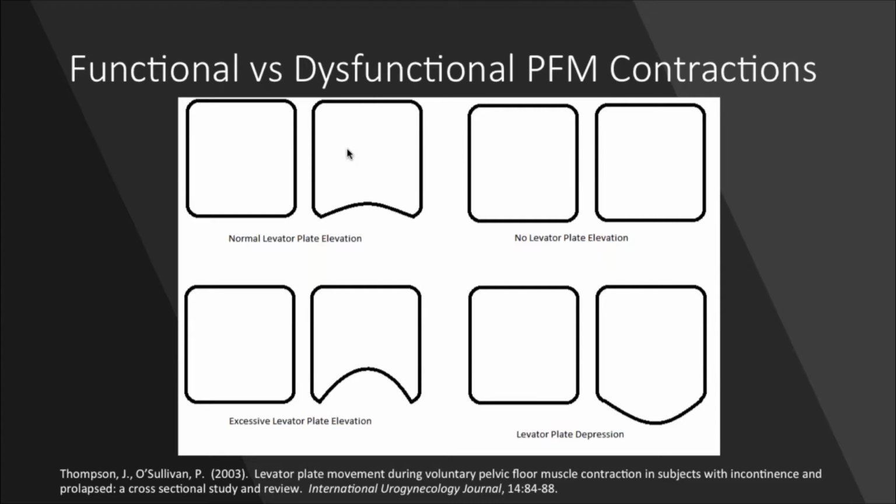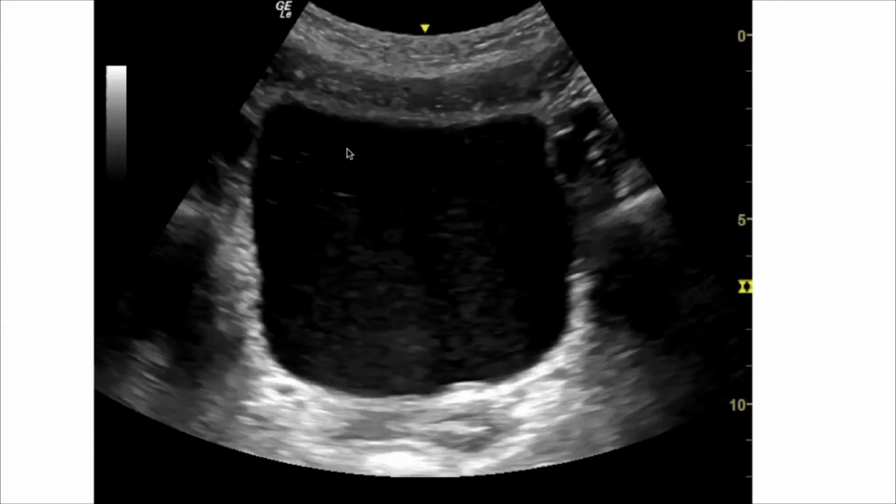So when we're looking at this image and we ask our patients to do a pelvic floor contraction, what we're going to assess is: is there any movement of the bladder or any movement of the levator plate, and do we see the lift? Do we see a depression? Is there an excessive amount of movement? And then we can assess, are they able to cognitively make this contraction, and can this contraction occur automatically without us instructing them?